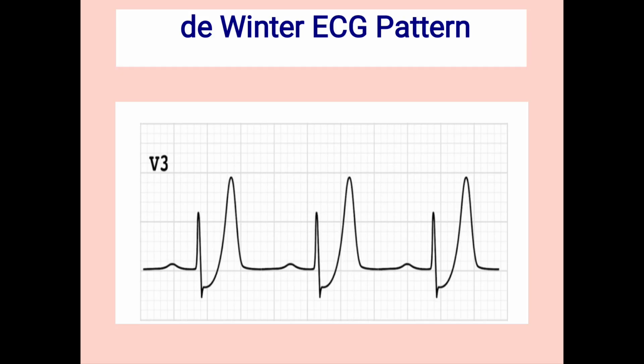Hi friends, today I will talk about the Winter ECG sign, which, though infrequent, is an emergency if it is detected in ECG.